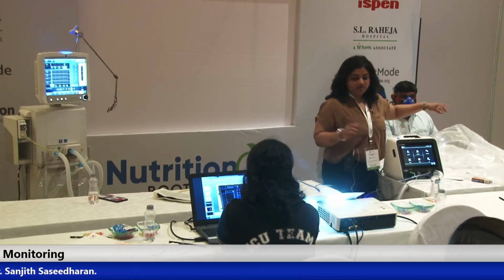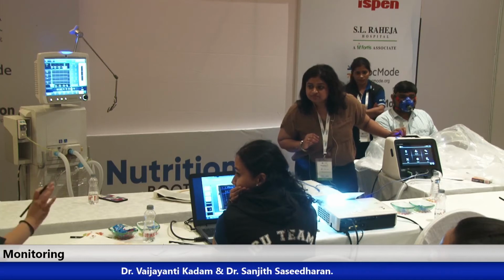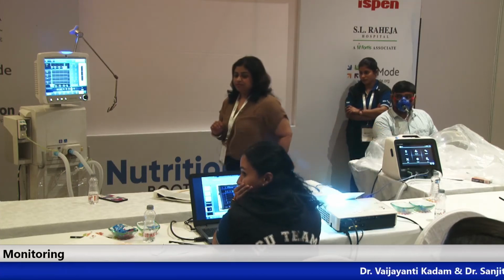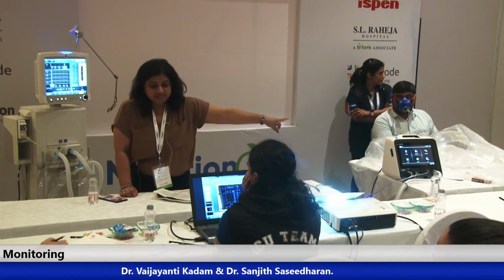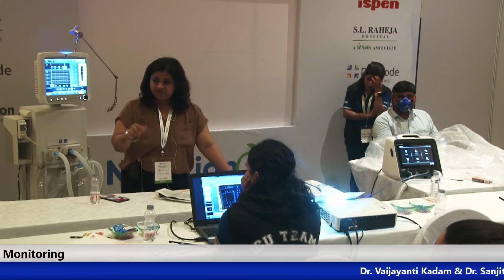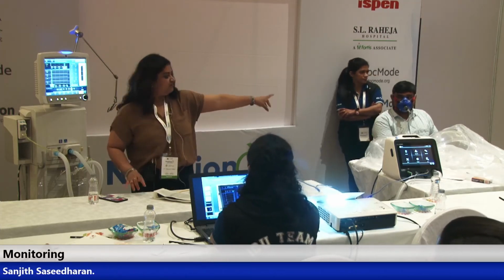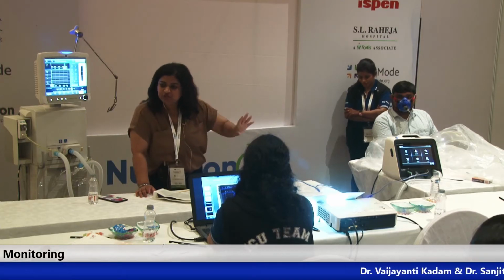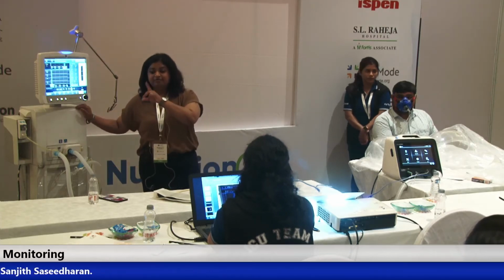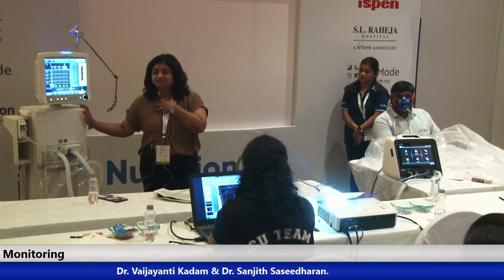Okay. Now he is attached over here. For the desirable time till the steady state is achieved: once the steady state is achieved, as I said, less than 5% and 0.8 RQ, we immediately remove it. If we have achieved the steady state in 2 minutes, we can stop this measurement and get that reading. For this one, it will take you a minimum of 30 minutes for the steady state to occur, because it is the measurement of the gas exchange occurring in the lungs, not in the machine.